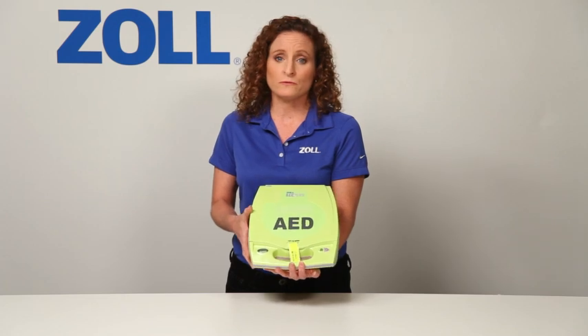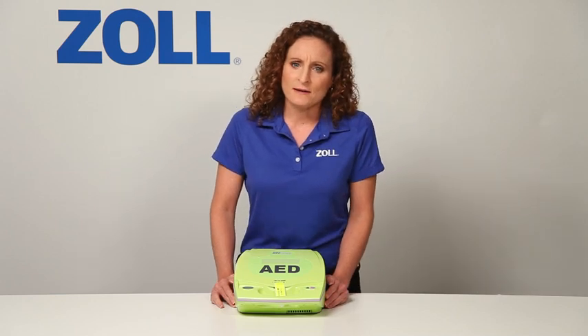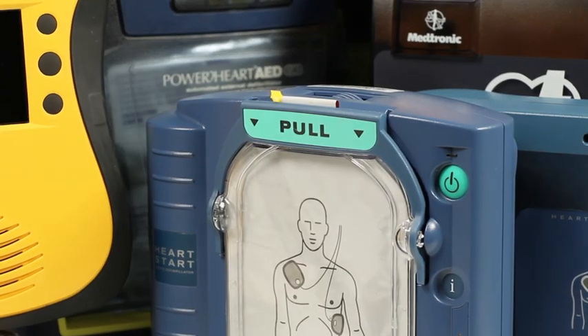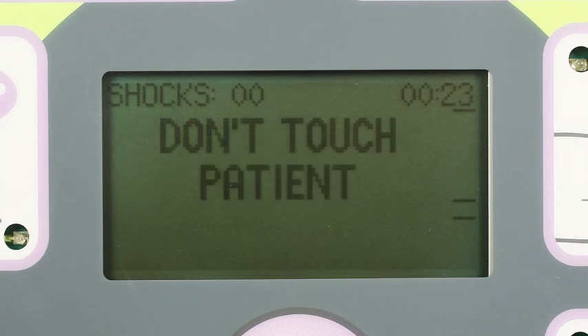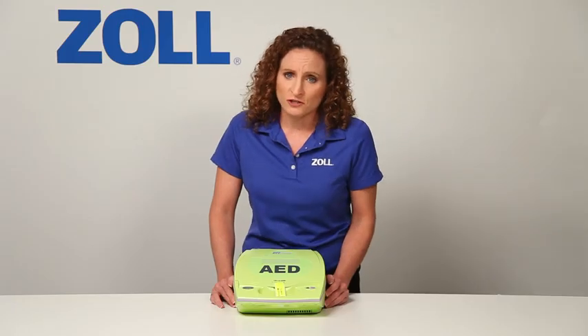Actually, most don't. At best, they only help about half the time. Other AEDs can shock just fine, and so can the AED Plus. Yet many people don't know this. Research shows that when an AED is attached to a victim of cardiac arrest, it will advise a shock only half the time.